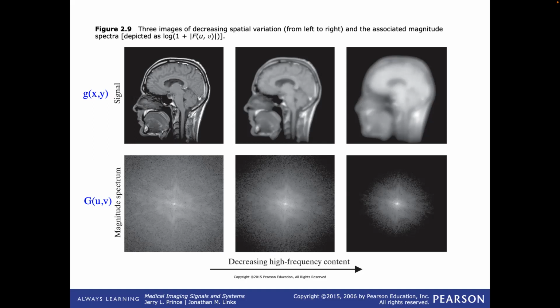It looks blurrier. And if we have a modulation transfer function that falls off even more quickly than this one, by the time we get out to these spatial frequencies, we're down at 0. And this is what the image looks like. So it's very blurry at that point.